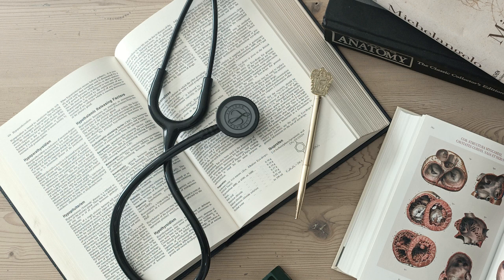Rule number 2, always analyze the P wave first. The P wave, as we discussed, indicates atrial depolarization. So any abnormality in the atria, whether it's a bradycardia from SA node dysfunction, ectopic beats originating in the atria, or tachyarrhythmias like flutter or fibrillation originating from the atria, will manifest as an abnormal P wave. Your action should always be to look at the P wave first and determine, is it there? Is it normal in shape? Is it fast, slow, irregular, or even missing?